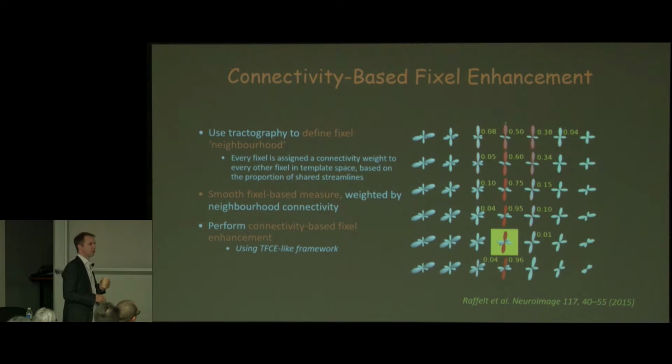So I don't know if anybody's familiar with the threshold-free cluster enhancement framework that Steve Smith proposed a while back, but it's basically about boosting the t-values in a particular voxel based on the t-values in the neighborhood of that voxel. So if they're all going to have positive t-values, then that increases the t-value in the particular voxel that you're interested in. Well, that relies on a definition of the neighborhood and the t-values in that neighborhood.